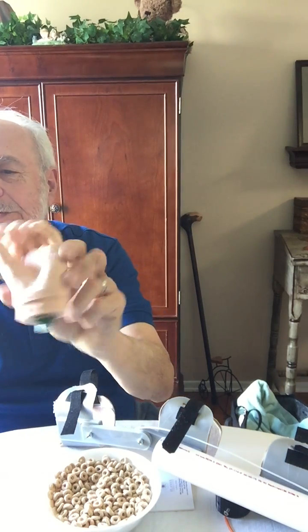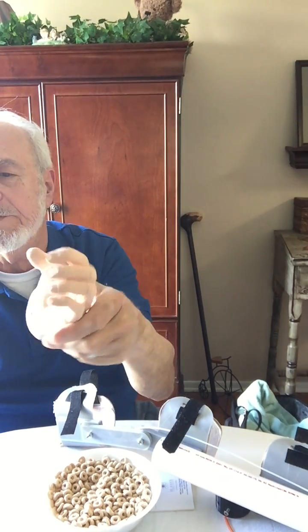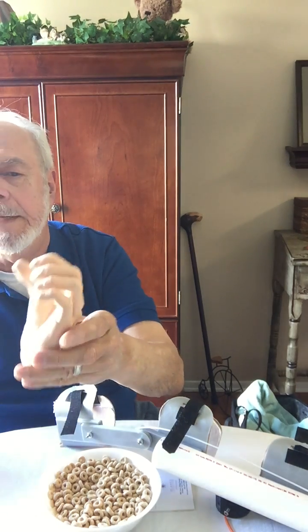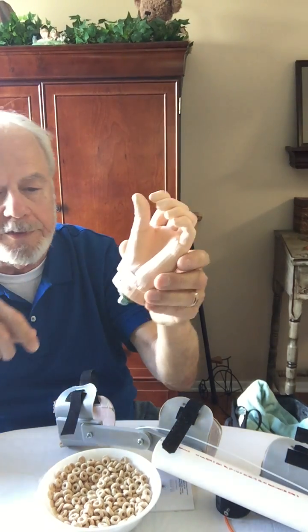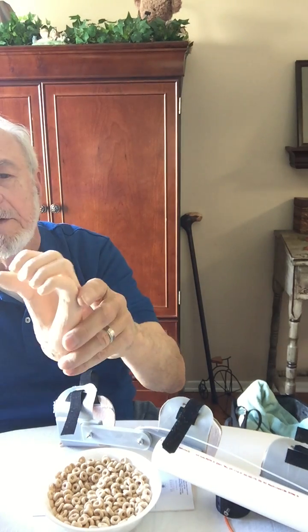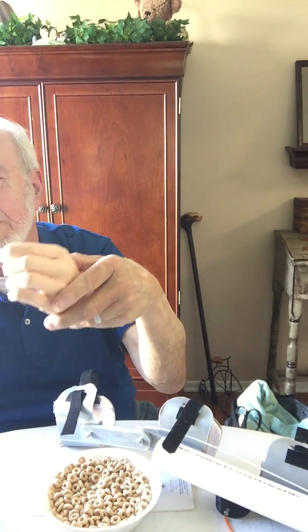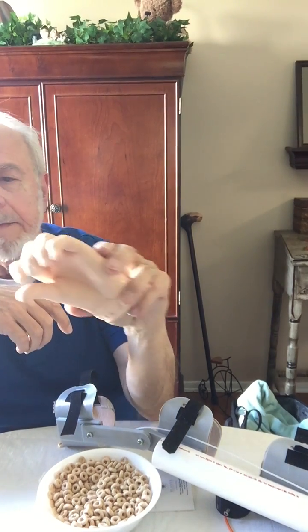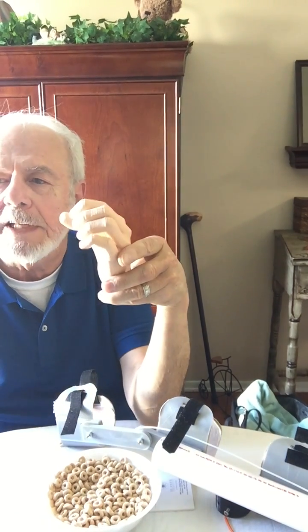Yeah. For instance, Justine, here's a hand that is primarily cosmetic. It's supposed to look more like a hand, but there's a little space between the thumb and the fingers that can be used to grab a shopping bag or something like that. Or, you know, a thing that doesn't have moving parts can also be very functional. So that's an example. Good point.